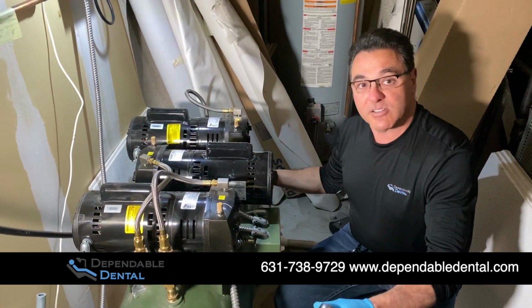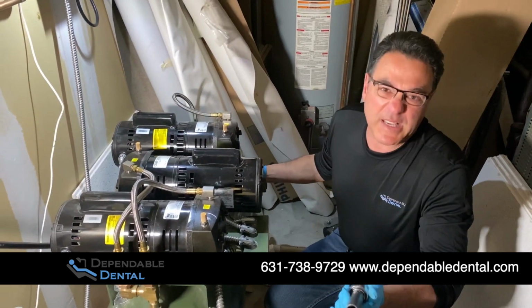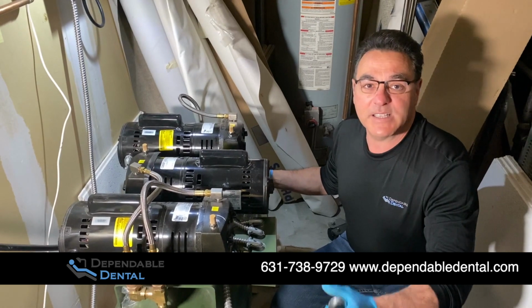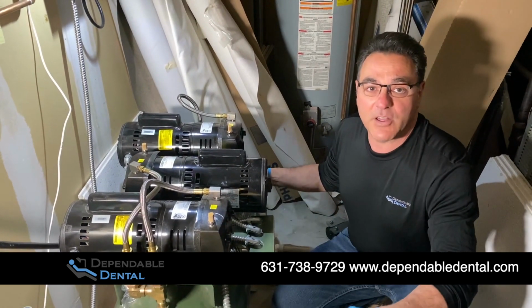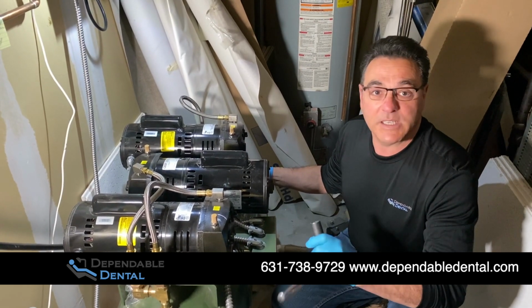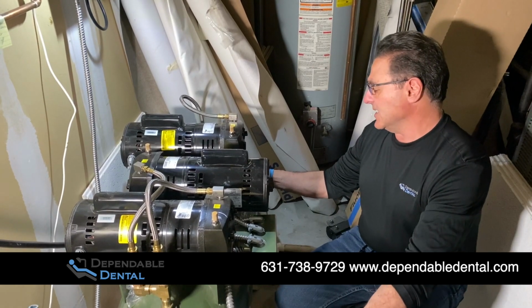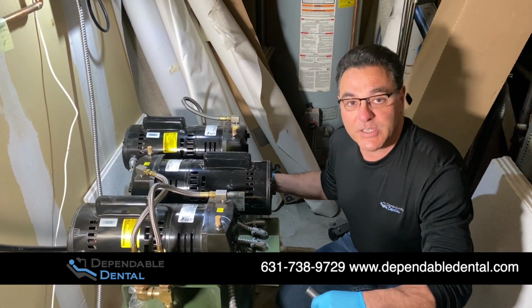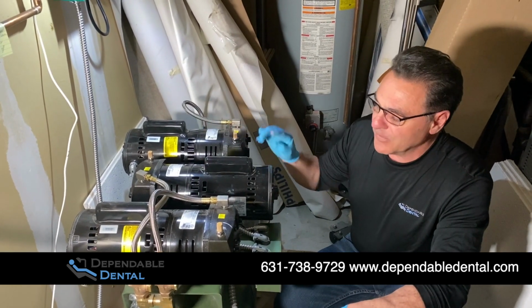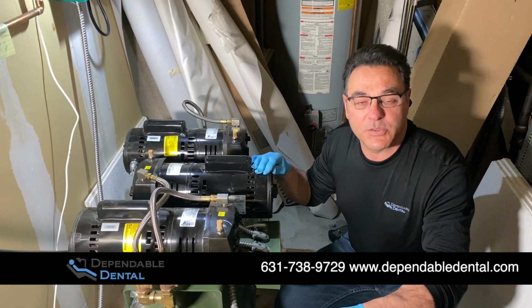I'll give you a little background on surgical suction units. We're talking strictly about dental, basically oral surgery, dental surgical suction units. The reason for that is these units are used in other applications within the medical world, but we are coming to you strictly from the dental oral surgery side. This is a DCI S3206, 3 heads. The 2 means 220, and the 06 means it's designed for up to 6 users.